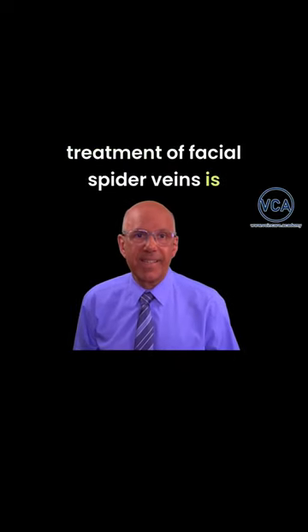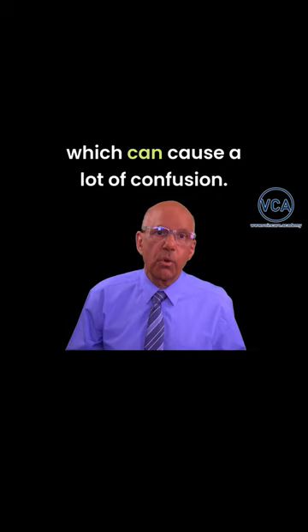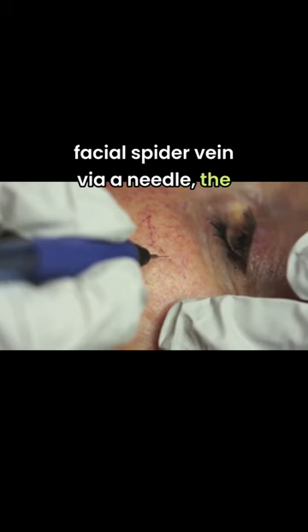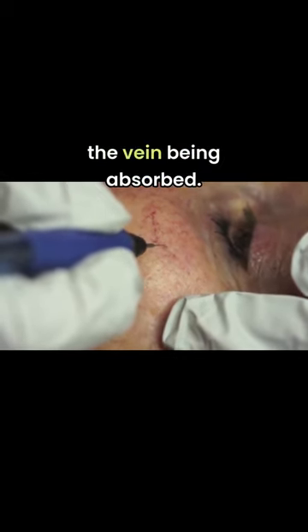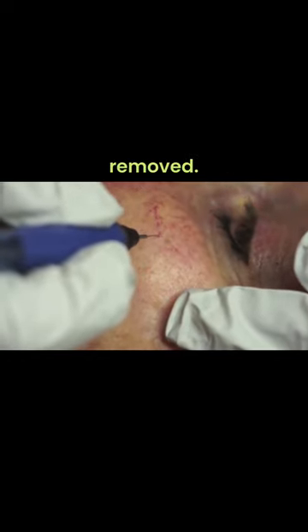Thermal treatment of facial spider veins is surrounded by many technical terms which can cause a lot of confusion. When heat is delivered to a facial spider vein via a needle, the intention is to cause a controlled injury which ultimately leads to the vein being absorbed. It heals by fibrosis and it is removed.